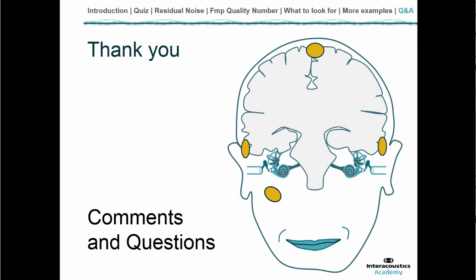Thank you, Jas. We have a question here. Can PAM impact on the FMP value? It's a very good question. I like it also very much.